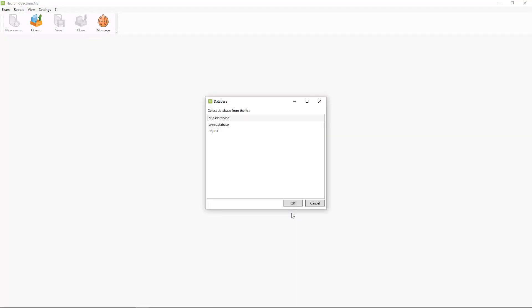Also, after first start, you need to select a database on your computer which you will use for storing your examinations.